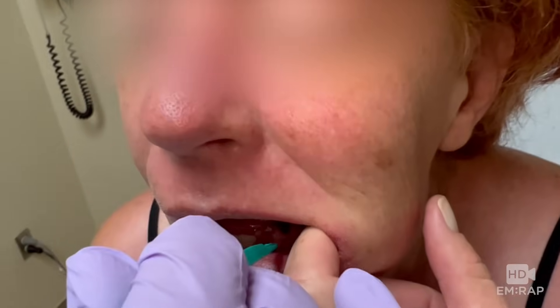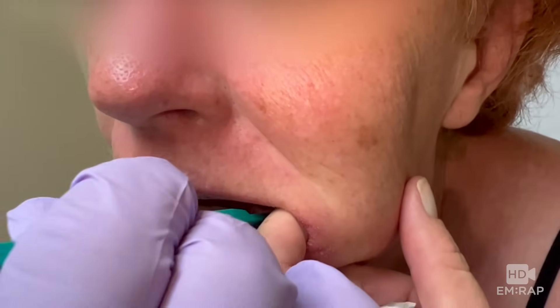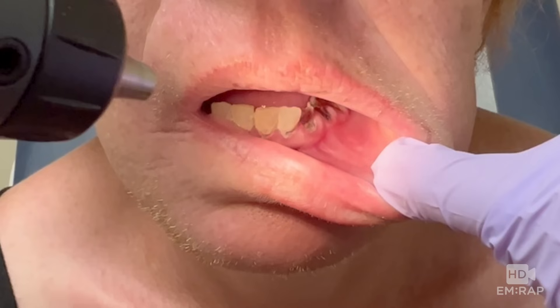Make a stab incision and suction the fluid. Since you can't see it so well in this video, the injection and incision were right here, right over the area of fluctuance, just like a skin abscess.